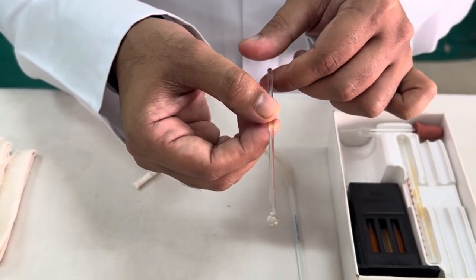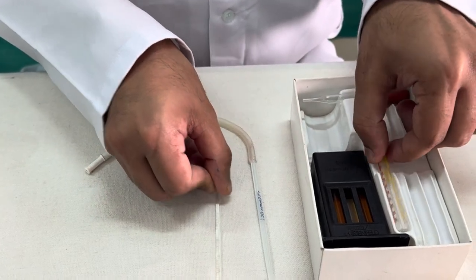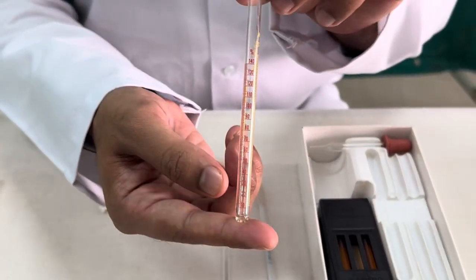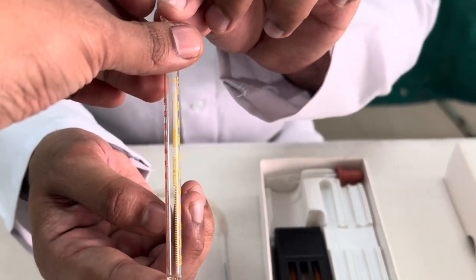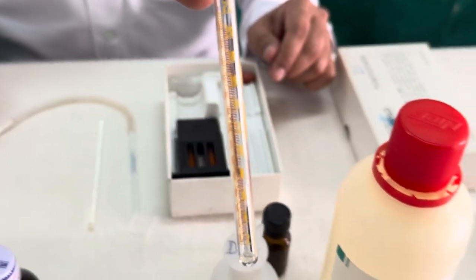Then this is a glass rod or the stirrer used to mix the contents. Then the most important one is this hemoglobin tube. Now there are certain graduations which are present on this hemoglobin tube.